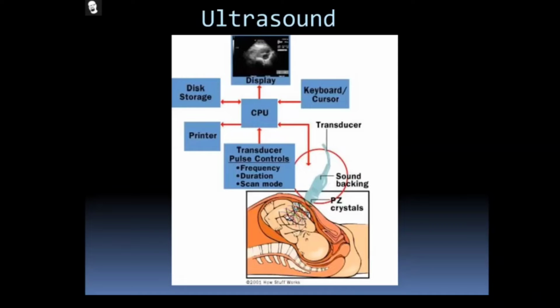In each and every patch we can store the image and see the image in different directions, in different ways. Through that we can identify exactly the condition of the internal organs. All of that we can see using the monitor. That kind of dragging, all those things, we can do using the keyboard present in the ultrasound machine. Okay, so the main important part is the probe.